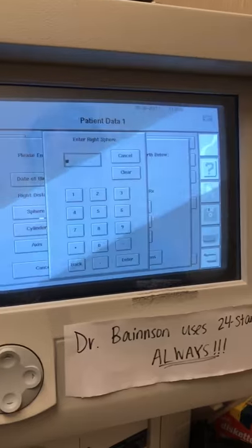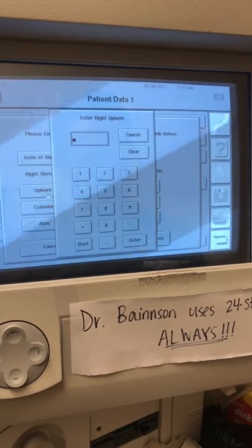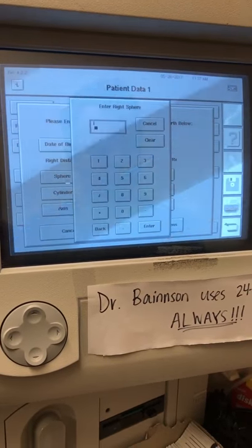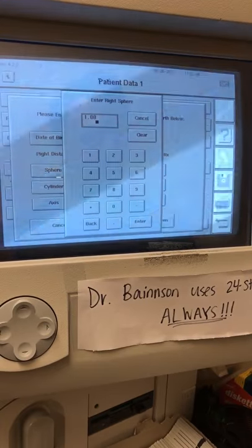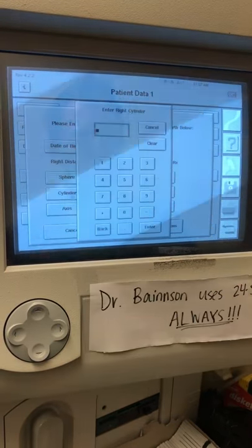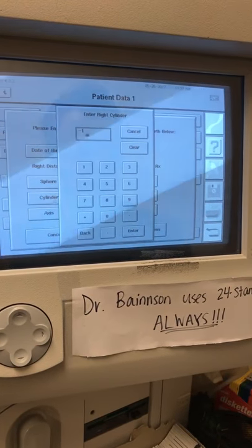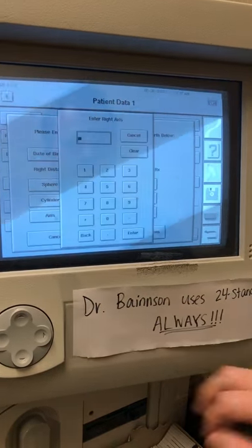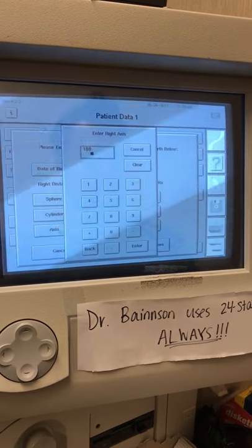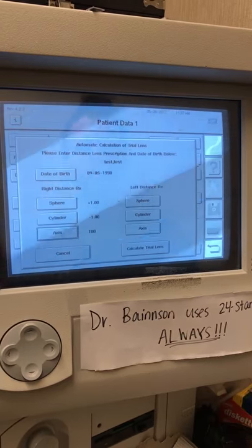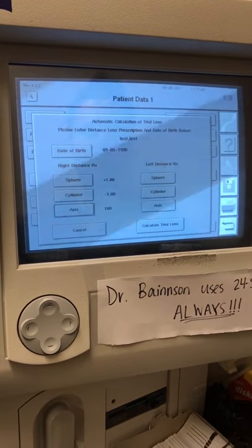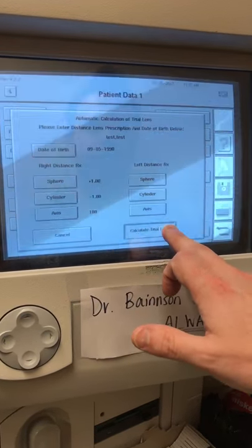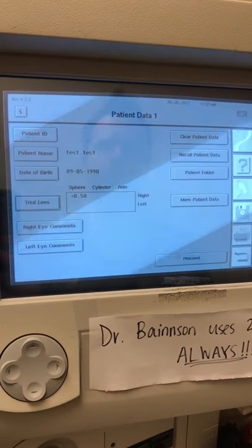In the sphere, we can put whatever we want. We'll put in a plus one and a minus one at 180 degrees. Based on the patient's age and their prescription, we're going to hit Calculate Trial Lens, and it tells us what to use.